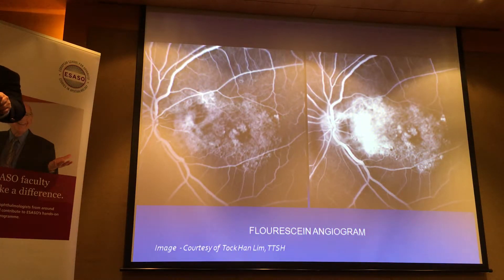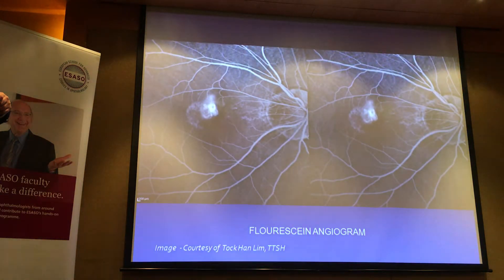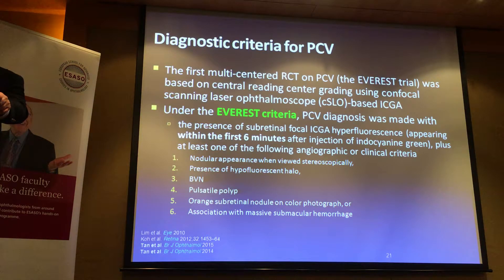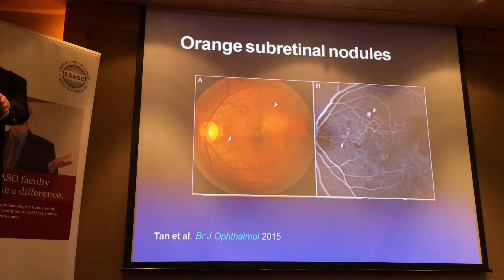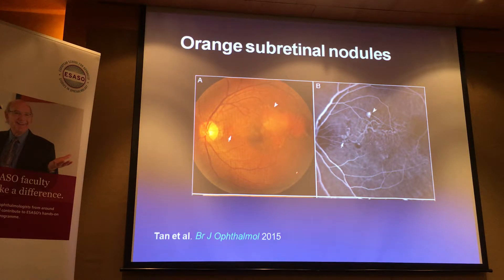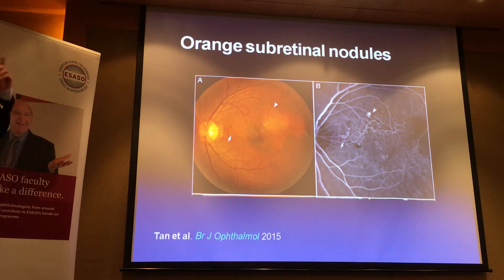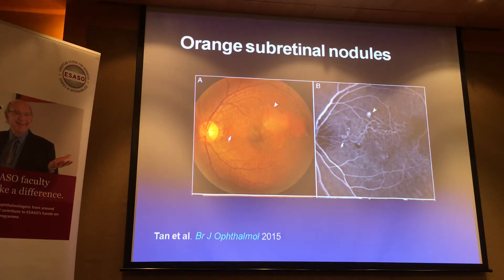Fluorescein angiograms show leakage, which is useful for identifying CNV lesions. But let's talk about PCV. I would reiterate that if you want a definitive diagnosis of PCV, you will require ICG. And this is how multimodal imaging helps you — on the color fundus photo you may already see orange nodules and a large PED, but on ICG you see both the polyps and the branching vascular network clearly, which you don't really see on the color fundus photo.